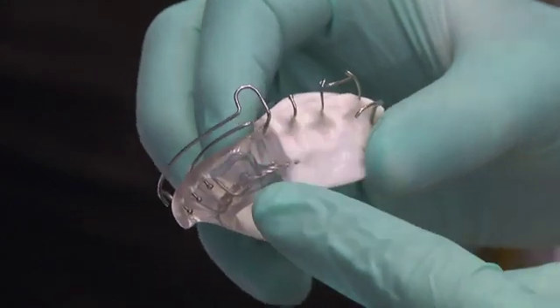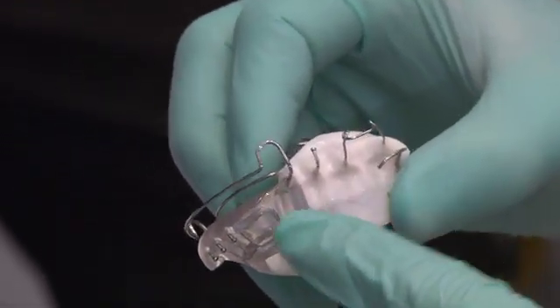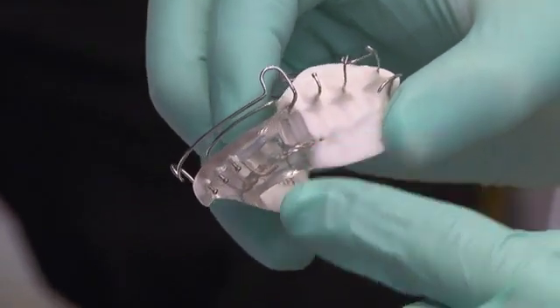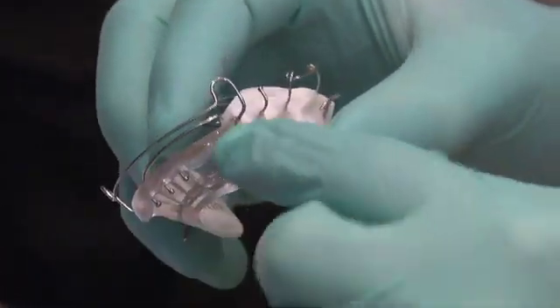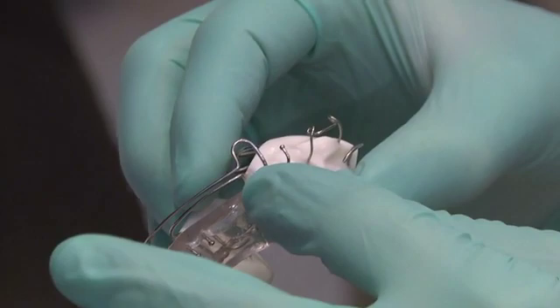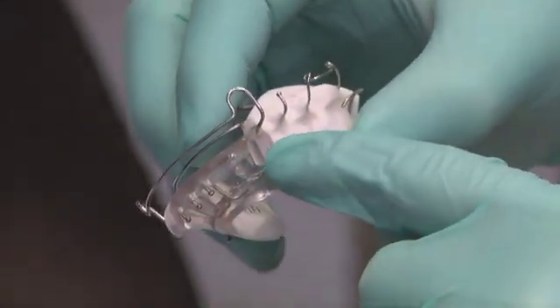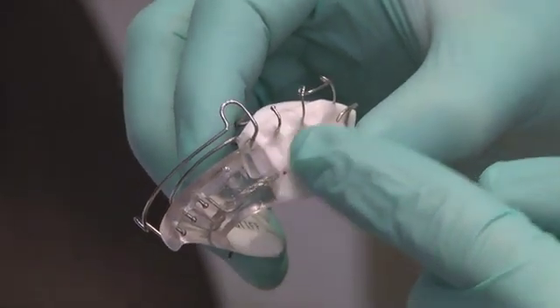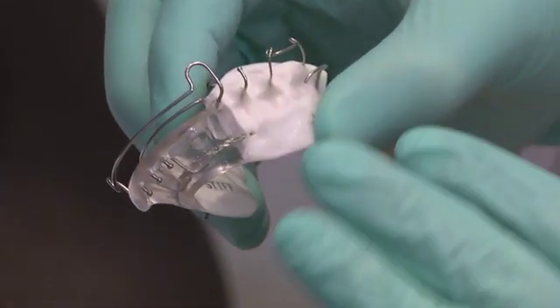Everyone can see the grooves here — this is what we adjust every visit. The appliance is placed in the mouth with articulating paper; the patient bites into that and we can see where the contact points are. We decisively trim those contact points such that we're encouraging the lower teeth to erupt vertically and mesially. That eruption allows more class 2 correction and more vertical correction.